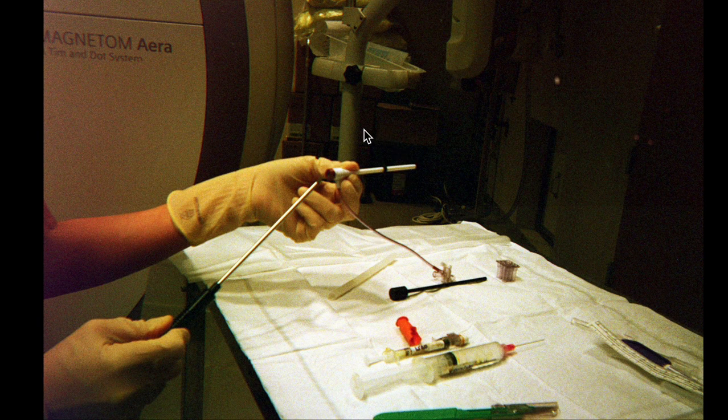I set up my device, so I have a needle here, and then I have an introducer. I'll call this the introducer. You have a blue ring here, which I remember was around 7 millimeters. So you would move that here so that you would know what depth you have to go to.